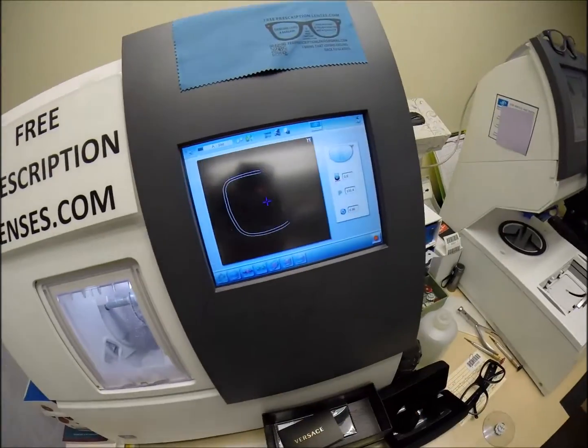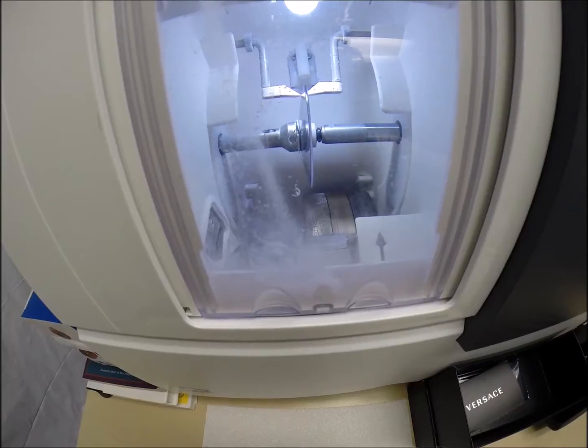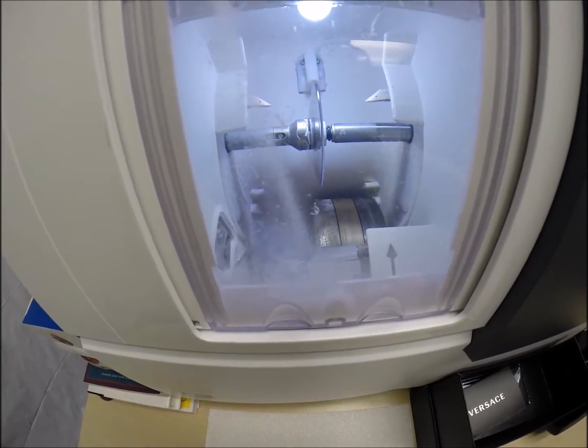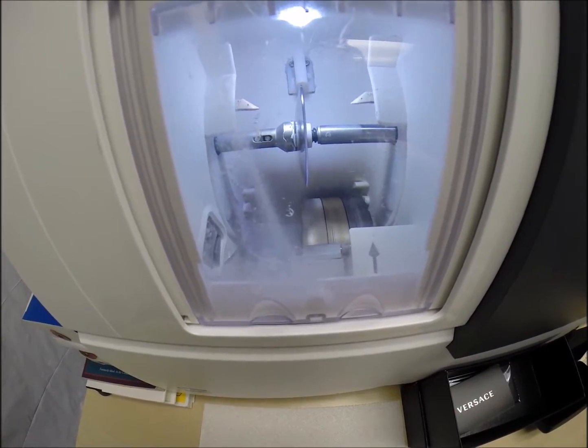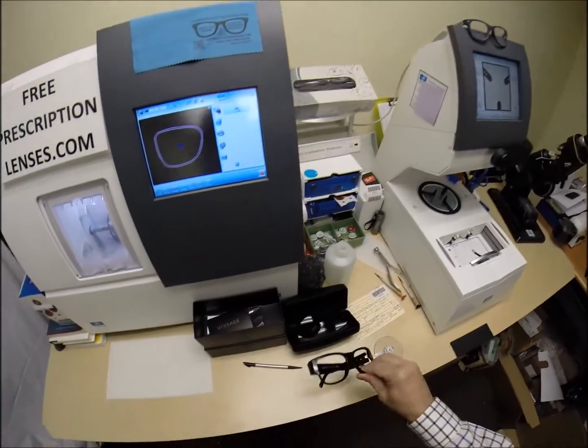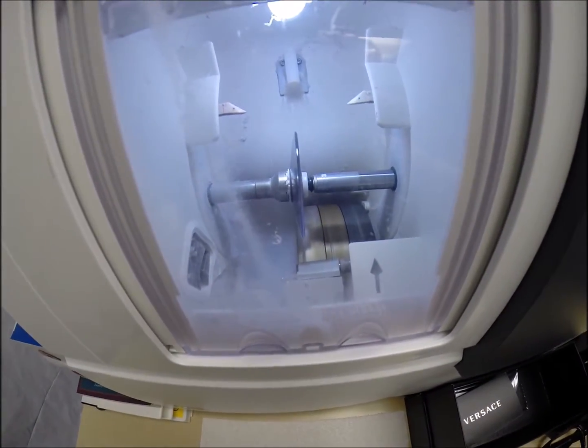You can see as it's tracing out the shape of the lens it's going to be cutting. And the old carpenter saying, measure twice, cut once. It's measuring the thickness of the lens at every point to know exactly precisely where to place the bevel so you have the least amount of edge thickness showing, of which you will have none in this frame, with it being non-prescription. And the thickness of this frame, it's going to hide any edge thickness whatsoever, even for fairly strong prescriptions.